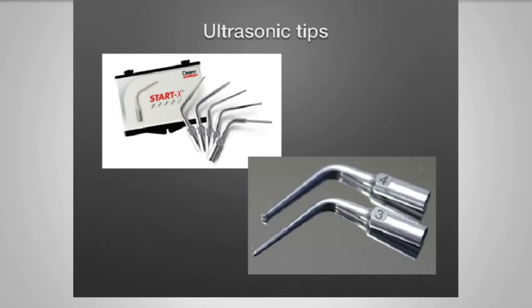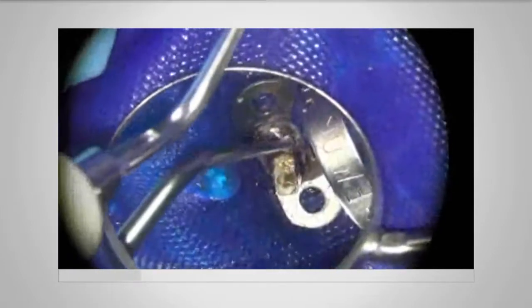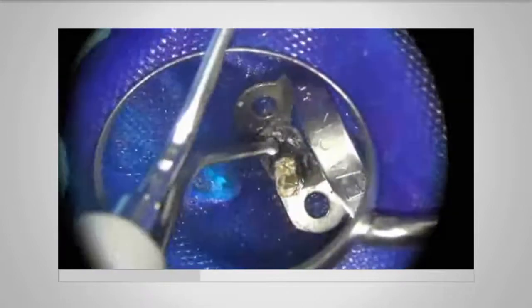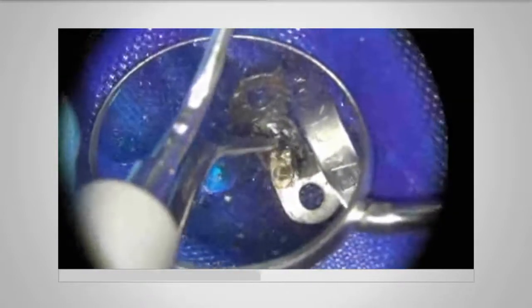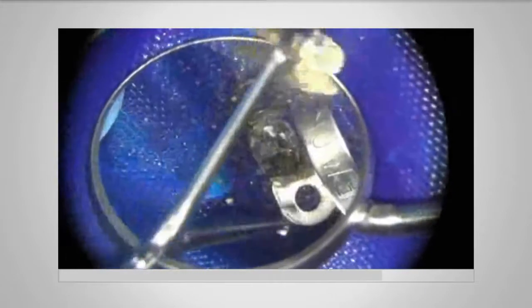So here we are, this is very simple post removal. We've made a little notch in the palatal aspect of the post. In comes the number 4 Startex tip on high power. Normally I'd use water spray, but obviously for video purposes that's not possible. So we'll just play that one again.